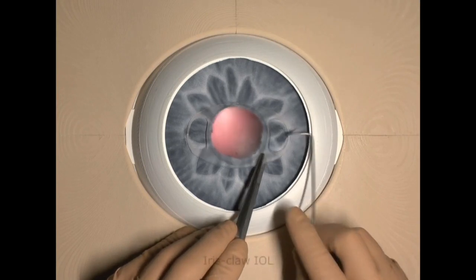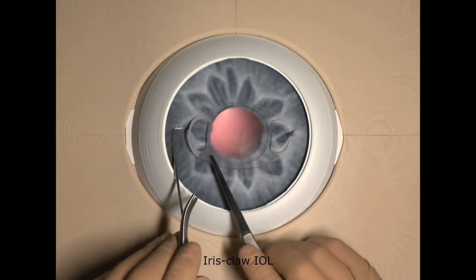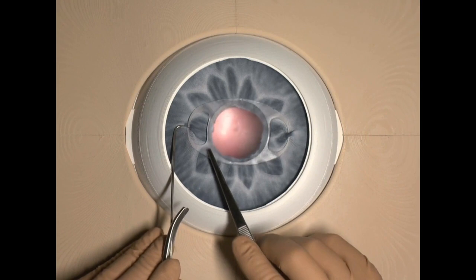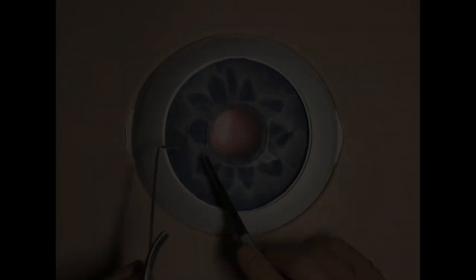Iris claw lenses can be fixated on iris inside anterior or posterior chamber. You have to remember to use different A constant for calculation.